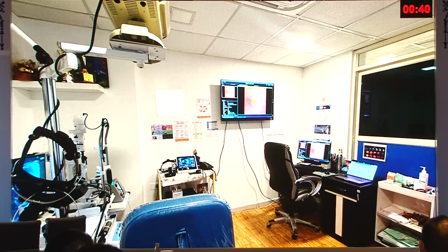So this is how my OPD setup looks like. Now in our practice, it's extremely difficult to convince the patient about the disease you are having. So I've got the imaging modality software connected to the TV, as well as my anterior segment connected to this TV. So the patient can have a look in real time at what exactly they are dealing with, and I can actually show them what exactly the problem they are having. So this is my setup there.